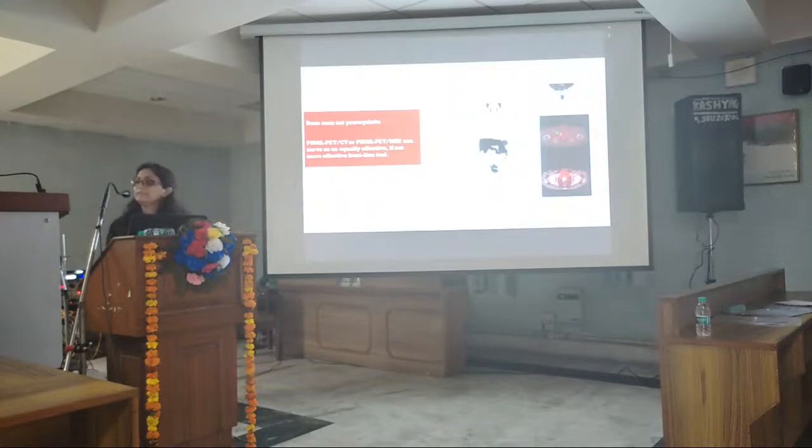But nowadays PSMA is preferable because it shows metastasis elsewhere also. So we go for the PSMA scan. If I have to summarize the recent guidelines in one sentence, which Dr. Manoj sir also mentioned: in the NCCN guidelines, the most recent guidance, MRI, bone scan or conventional imaging is not a prerequisite for doing a PSMA PET-CT.